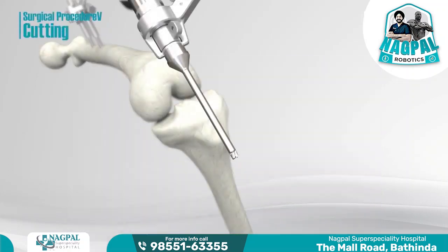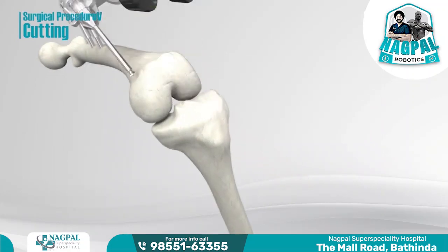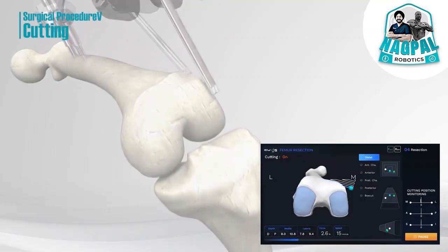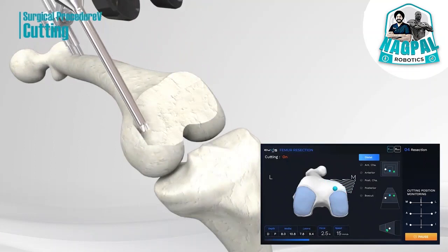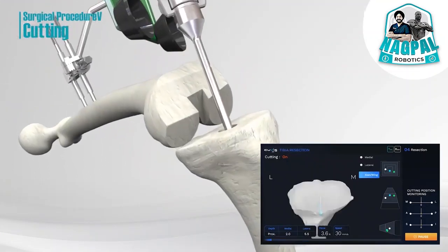Once the surgical plan is confirmed, the cutter moves freely within safe guidelines. The robot performs the milling, and if the cutter is out of the boundary, the robotic arm automatically stops. It also can perform bone resection while modifying the surgery plan.